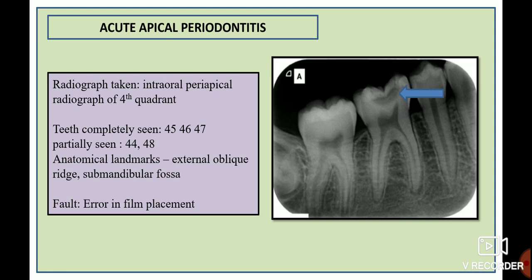In the crown portion, there is an ill-defined radiolucency in the occlusal aspect of 46, involving enamel and dentin and approaching the pulp, which is suggestive of dental caries. In the root portion, there is widening of the periodontal ligament space seen in the apical one-third of the mesial root of 46. These features are suggestive of dental caries with acute apical periodontitis in relation to 46.